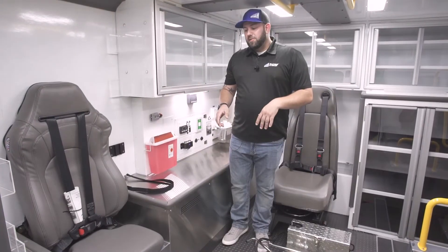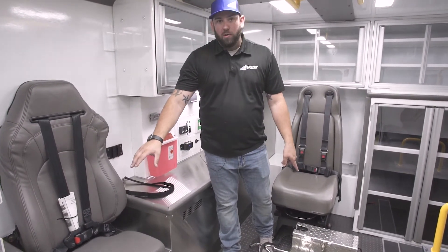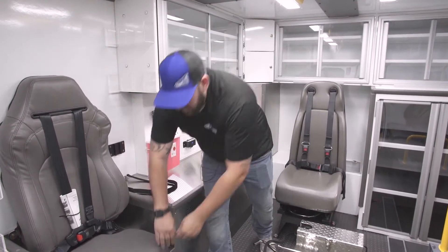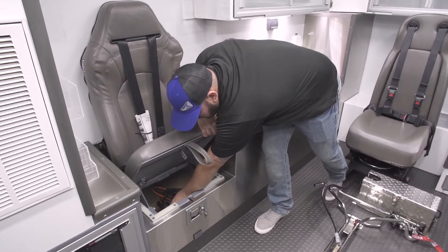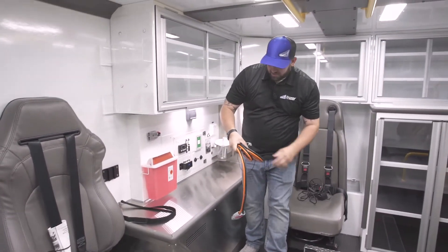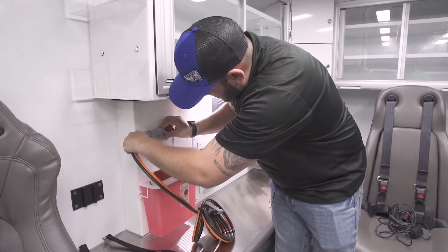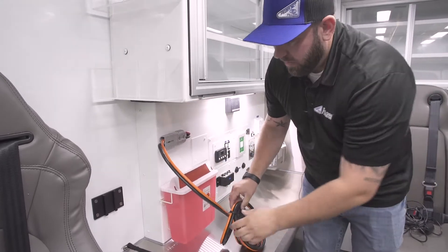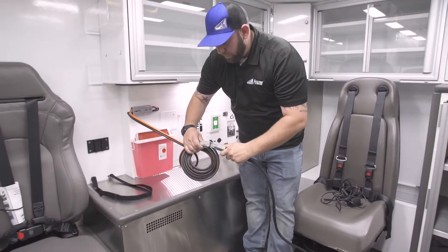For demonstration purposes, I kept the controller for the winch and the power harness under the seat in the seat storage. You can store these wherever it works for you. There's an orange and black power harness that's going to plug into the plug at the action wall, and the other end plugs into the harness of the winch box.